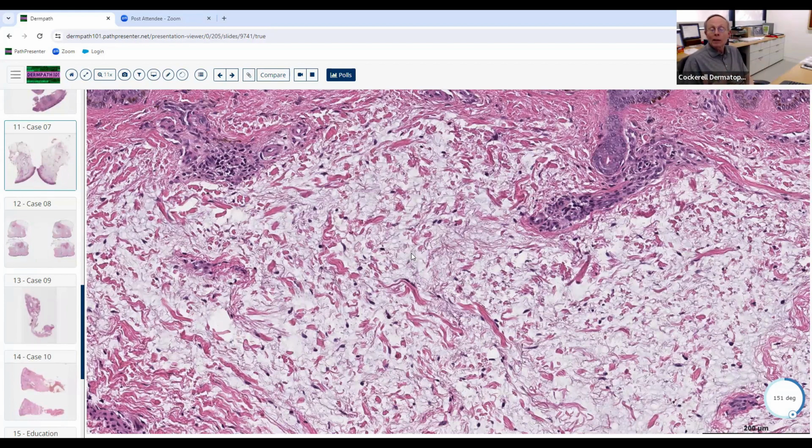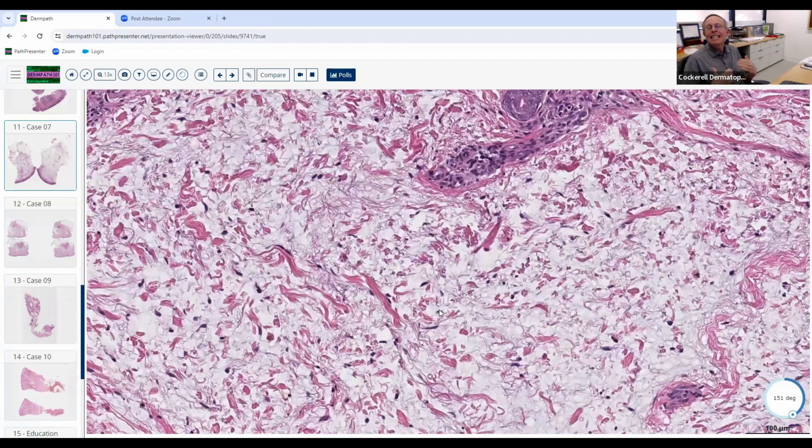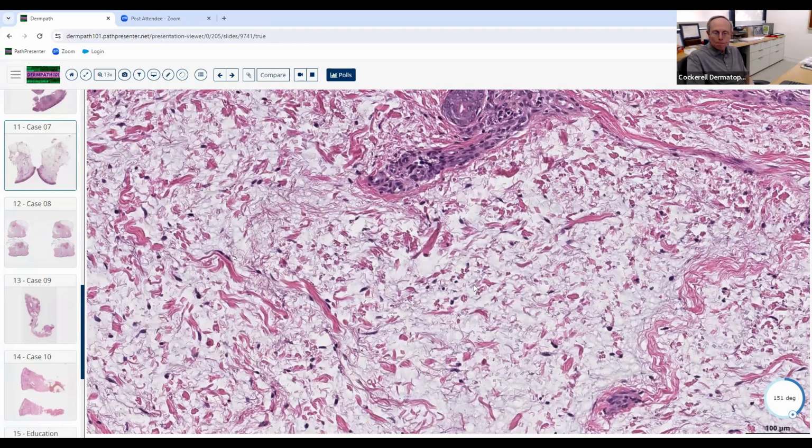So that's one that can look like mucin sometimes. The other time you can get this is massive edema. Patients that have horrible lymphedema, or they get metaphyma in the face, Morbihan syndrome, and they just get massive edema. That can sometimes give you this bluish gray color, and some of that probably is mucin in there also. But you're right, not too many things will look like this.